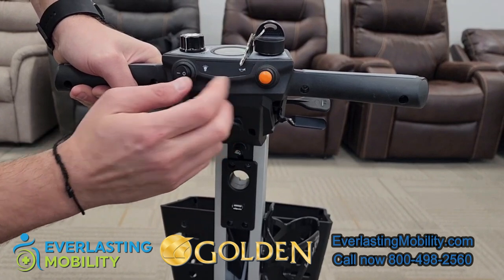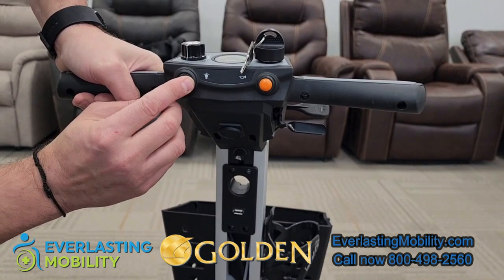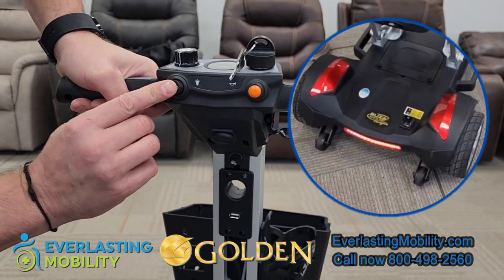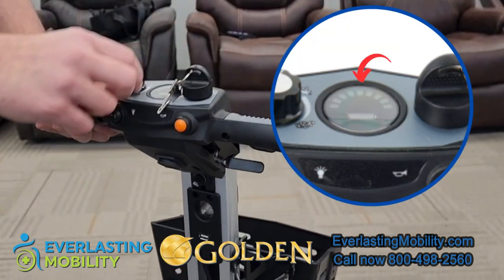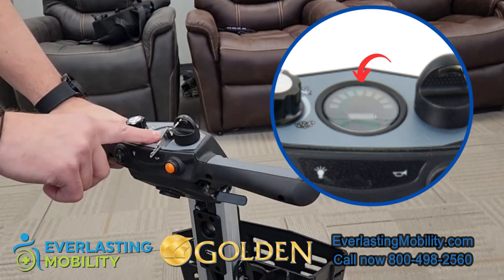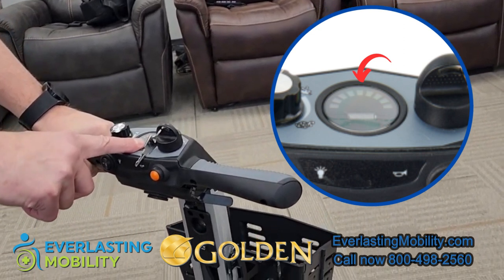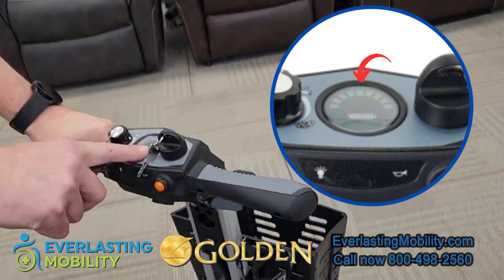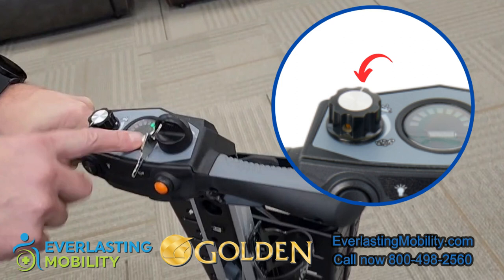This yellow button is the horn, and the button on the other side is your lighting control — that's how you turn on the two front headlights and the rear tail light when riding at night. The scooter comes with two keys to operate it. There is also a battery gauge with indicator bars; as the battery depletes each bar disappears. We recommend recharging when it gets to around halfway down to maximize battery lifespan.